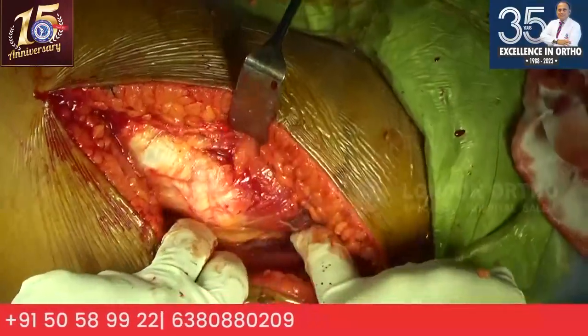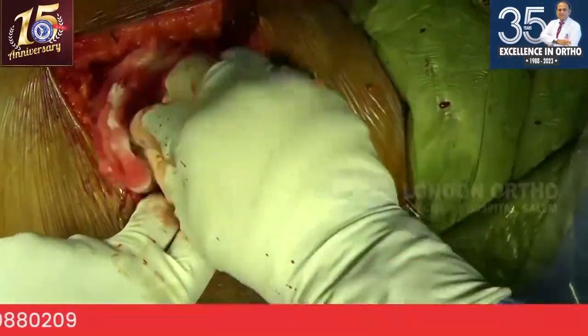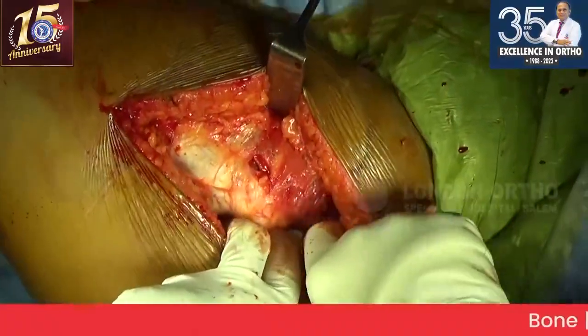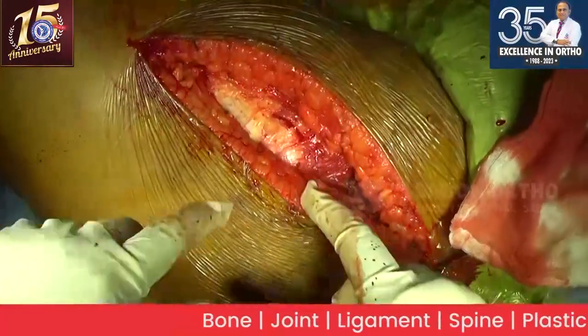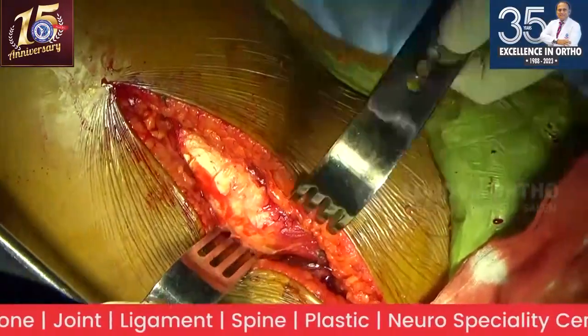At this level, the approach is pretty much the same. And then the gluteus medius from the ilium, I will be teasing it off with the periosteal elevator and do a complete capsular release, much more than what I do for a routine THR.